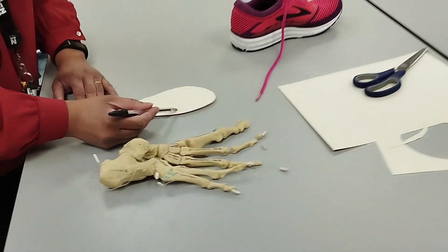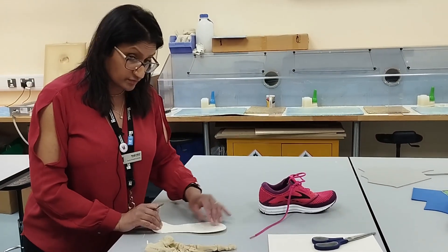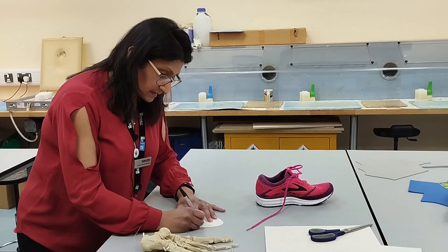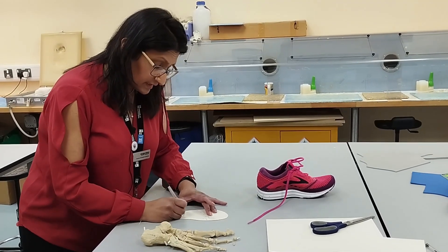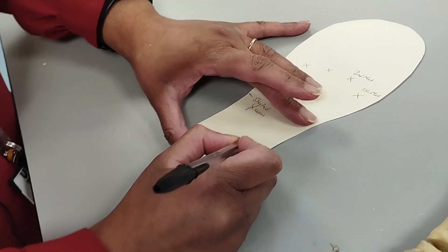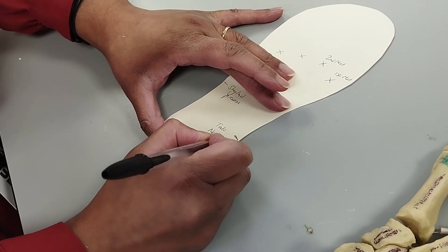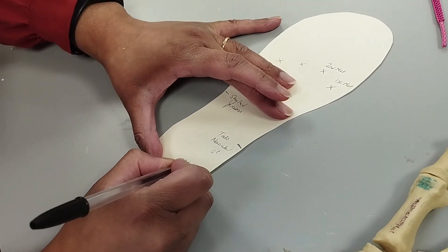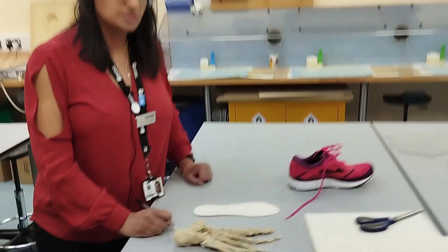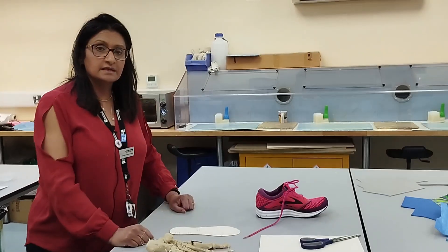There you have your 8 points needed for the template. For your OSCE, mark them as 1st met, 2nd met, and so forth, styloid process on the lateral side, talonavicular joint, and medial tubercle of calcaneus. Mark that with your name and number and then leave it to be picked up.